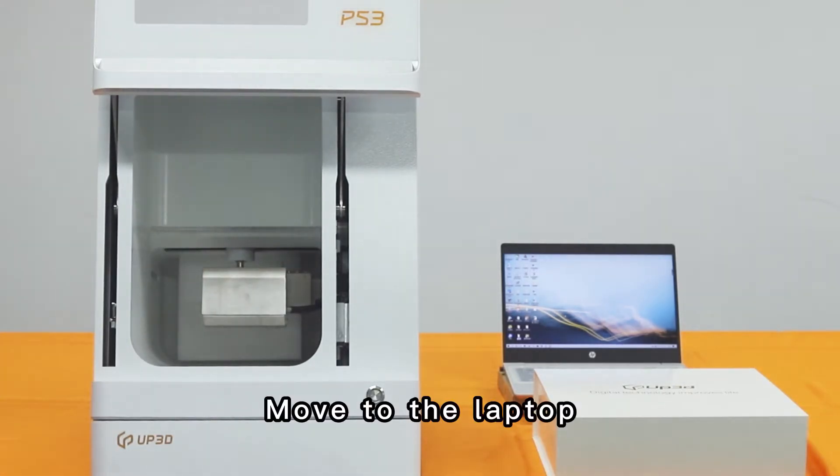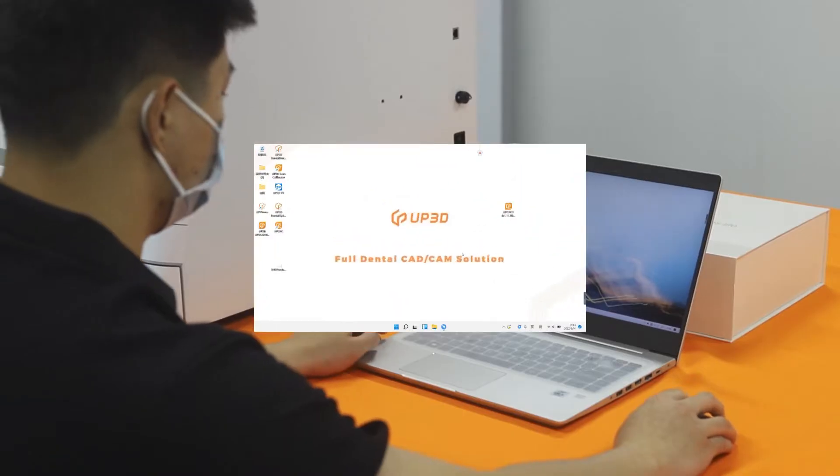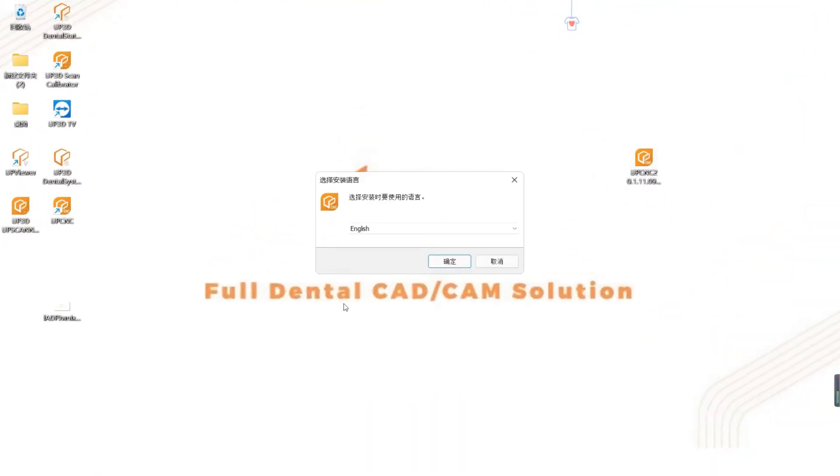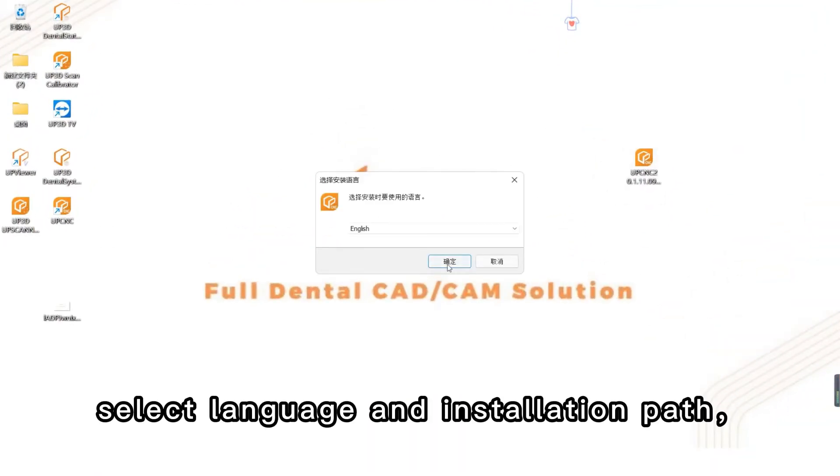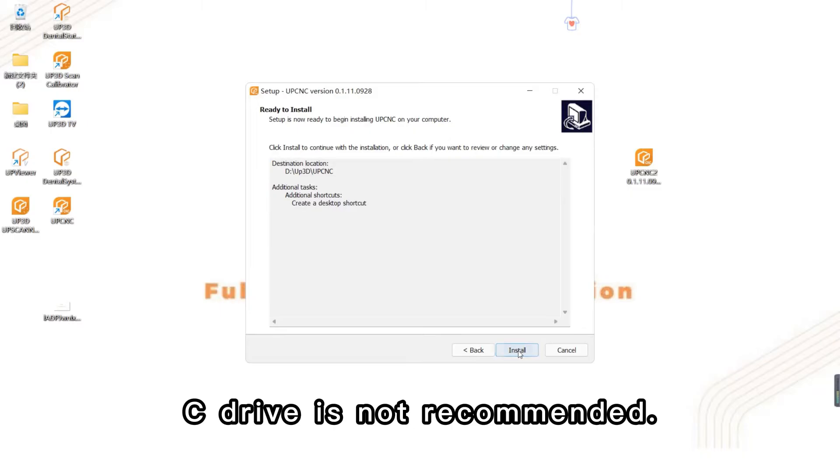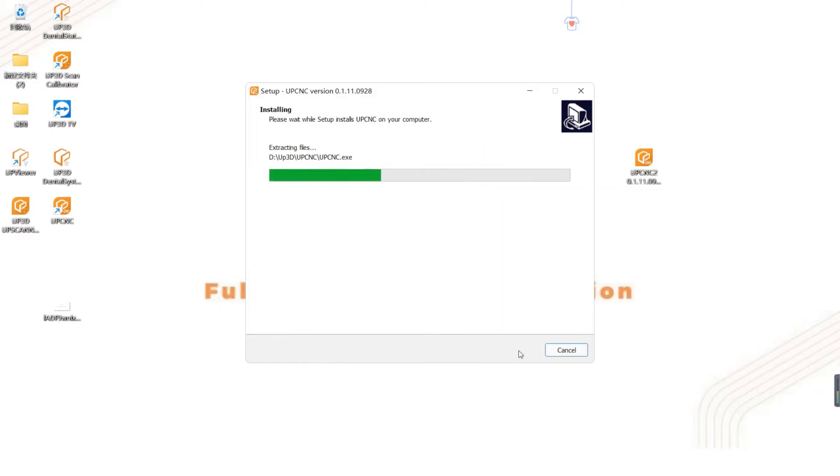Move to the laptop. Double click the installation package. Select language and installation path. C drive is not recommended.